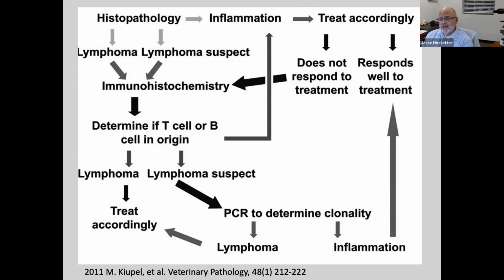I've got a question about eosinophil distribution, and this is from David, and I think what you might be driving at is that in some cases in the small intestine, especially the lower small intestine, distal jejunum and ileum, you'll see a band of eosinophils just deep to the crypts. I see that a lot, and I have struggled with that interpretation over my career.